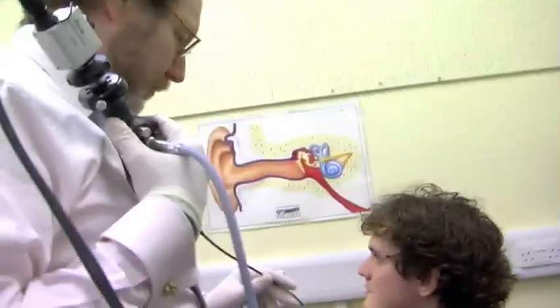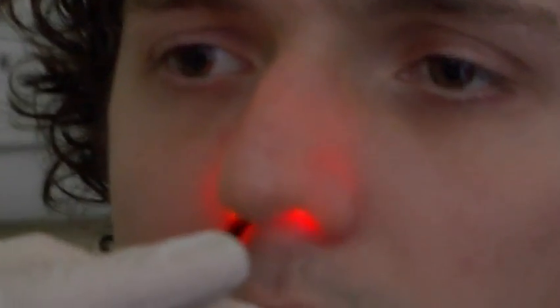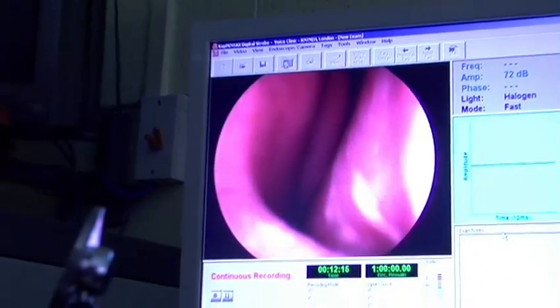Lower the lights, please, just for a sec. Let your head up for me. Let me know if there's any discomfort. You may just feel a little tiny something at the very beginning because the nose is just a little bit narrow at the very beginning. So this is the edge of the nose. We see that Daniel has a little septal spur, which I'm going to go around. We're inside the left side of the nose.